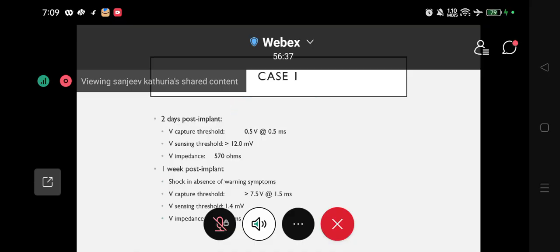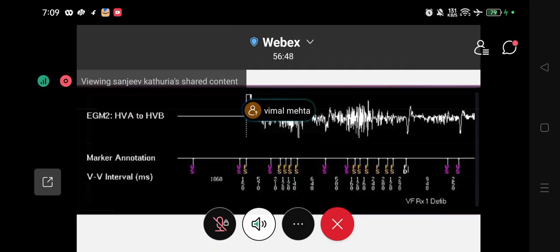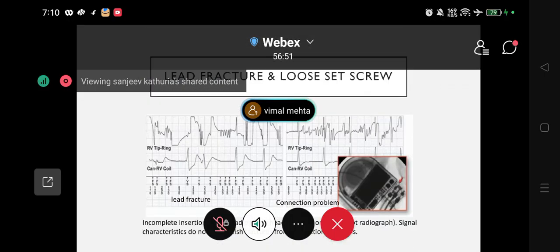Now, in this context, please explain what sir is asking. An amplitude of at least 5 millivolt. So the bigger the R wave, the chances of the machine acting on something like small myopotentials will be unlikely. But it will depend on a very good implant technique. Because if you are getting a voltage of something like 8 or 9, then small voltages will not affect the machine functioning. If you are not able to get it, let's say you keep it at 5, then as stated, you are in for a lot of trouble, as stated very nicely.